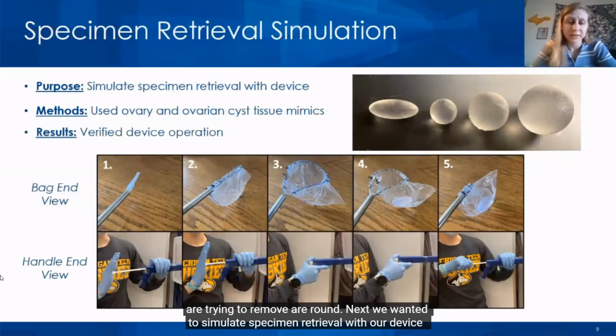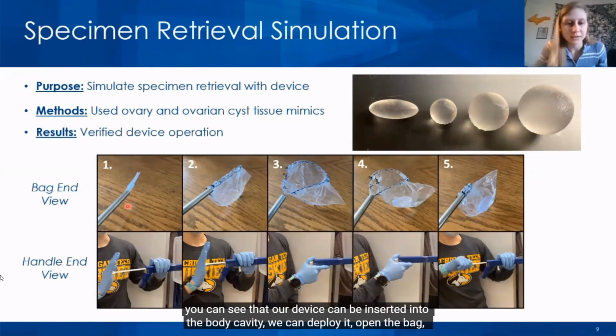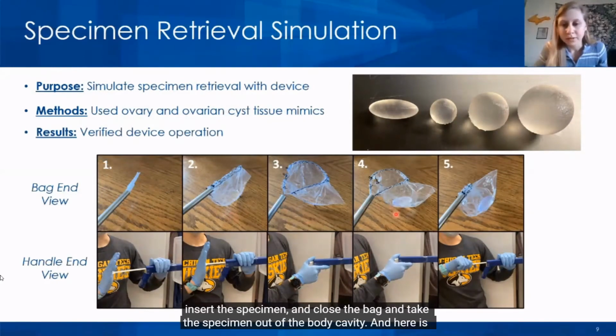Next, we wanted to simulate specimen retrieval with our device. So to achieve this, we made tissue mimics of an ovary and ovarian cysts of different sizes. Here you can see that our device can be inserted into the body cavity. We can deploy it, open the bag, insert the specimen, and close the bag, and take the specimen out of the body cavity.